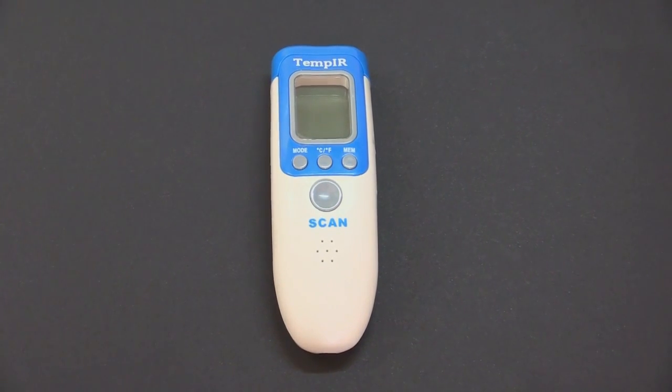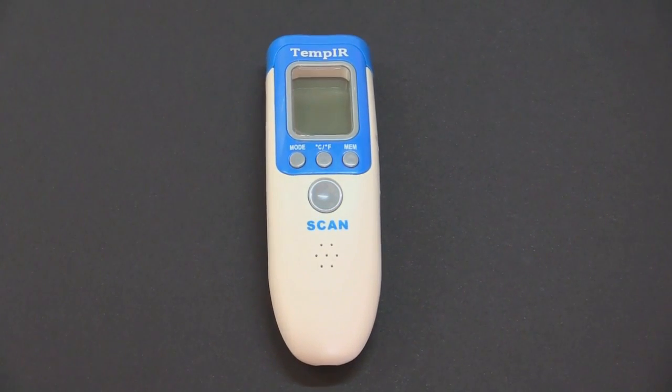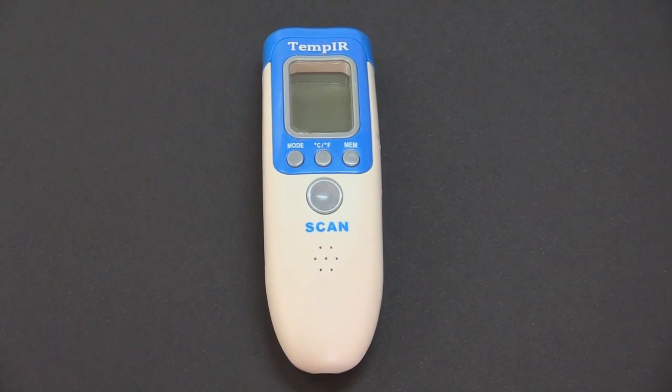As well as measuring body temperature, the Temp-IR infrared thermometer can also be used to read both surface and room temperatures.